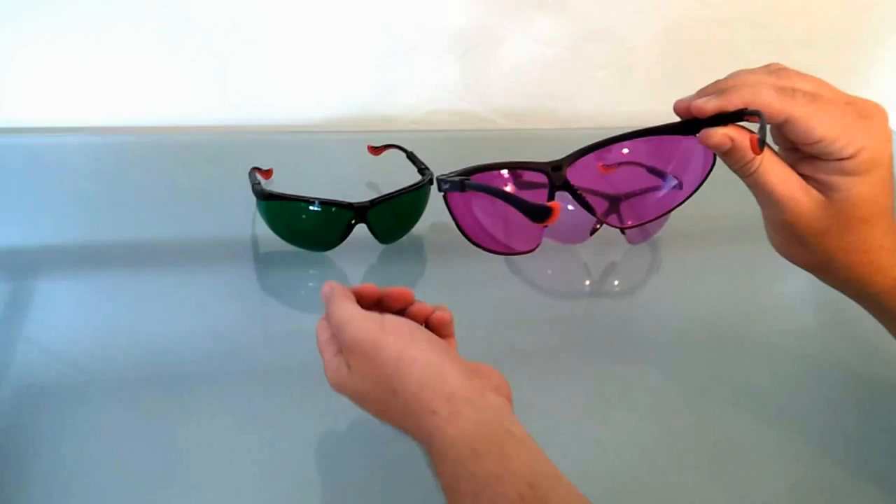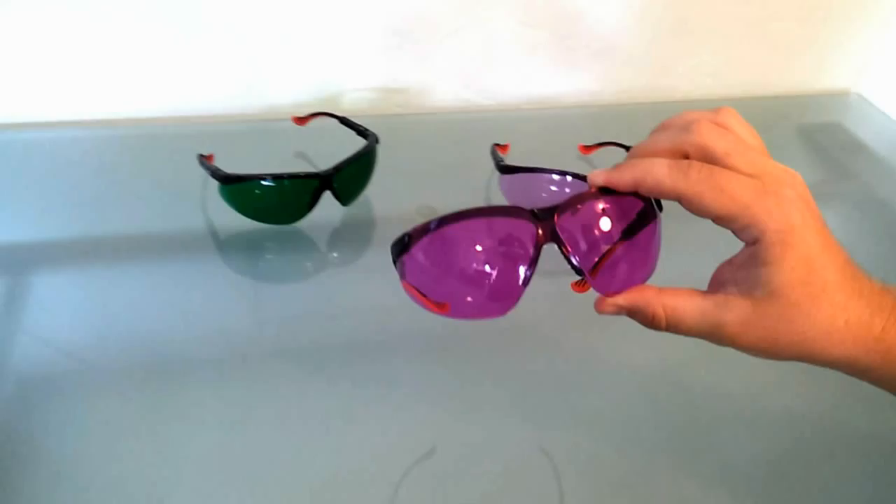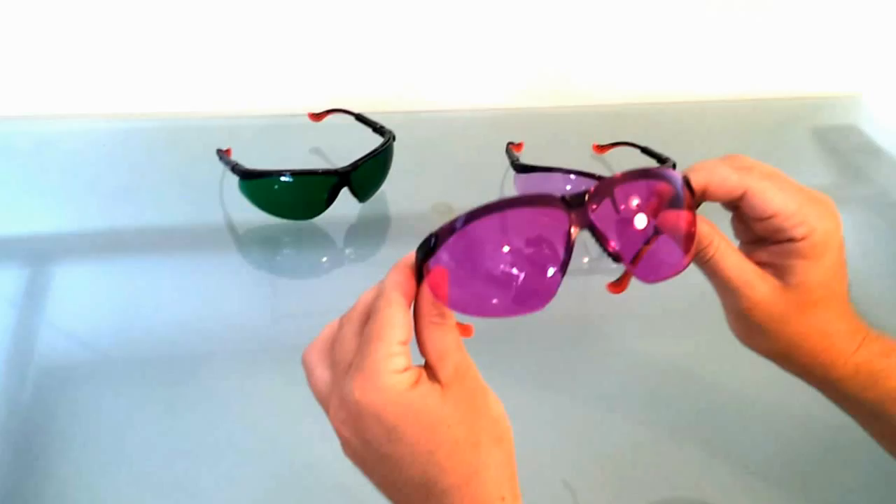They're extremely useful for phlebotomists, nurses, and other clinical professionals involved in medical procedures where the perception of vasculature is important. With these on, in good light, you will notice vessels and veins that were otherwise difficult to see.